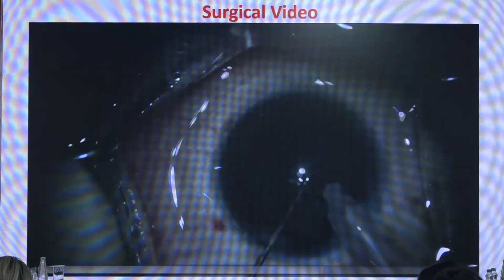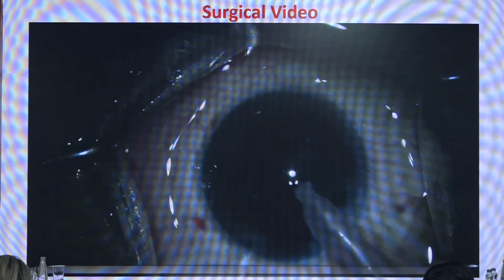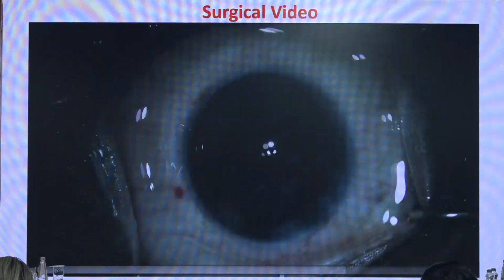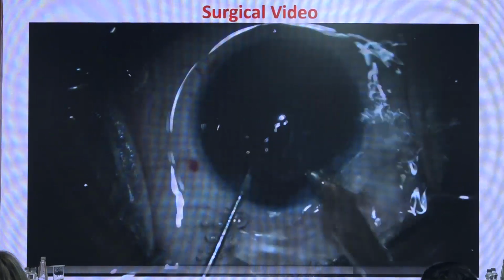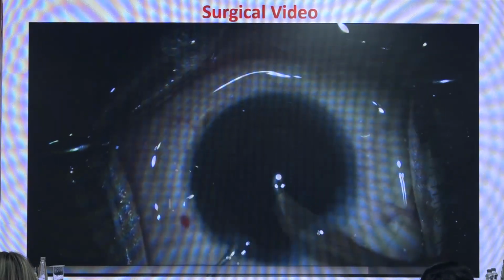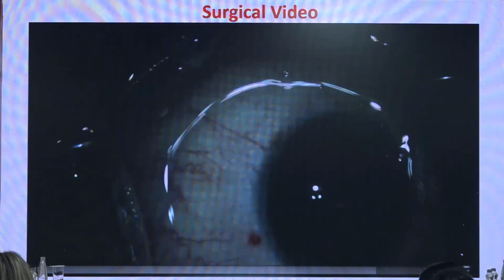before removing the phacoprobe, I inject viscoelastic from the side port to maintain the AC and to avoid fluctuations. Then prehydrate the wound a little bit. Then use the IA probe to remove the cortex. Again inject viscoelastic from the side port to maintain the AC. Then the IOL is injected.